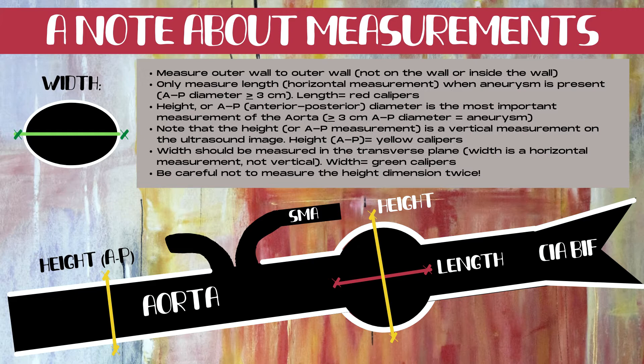When moving into a transverse plane of the aorta, the width should be measured. Note that width is a horizontal measurement, not a vertical measurement. Width is demonstrated by the green calipers on this image. One of the most common mistakes made is that the height or AP dimension is measured twice, meaning that you end up with two vertical measurements and no horizontal measurements.